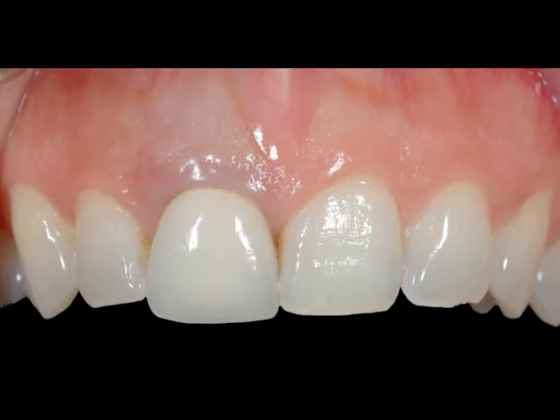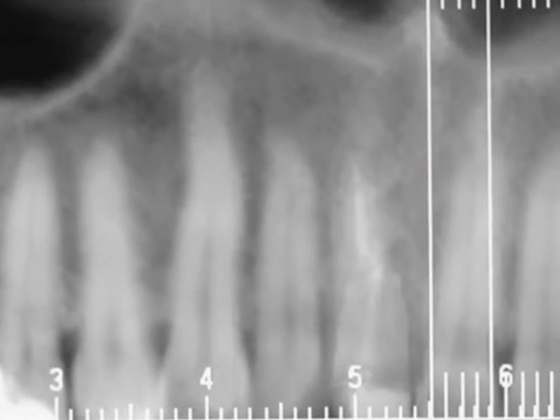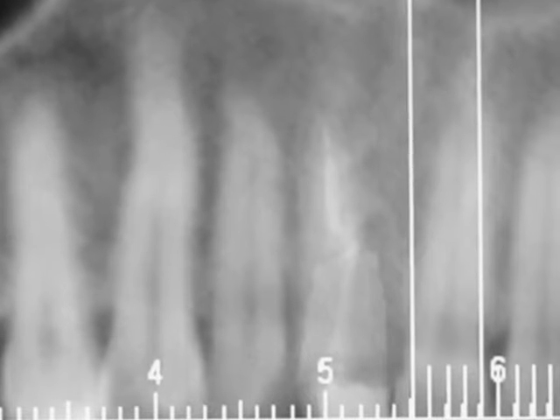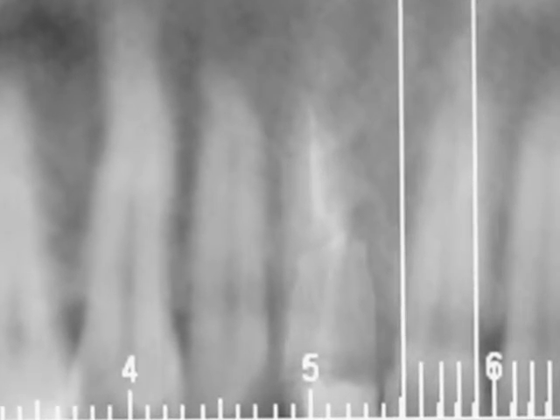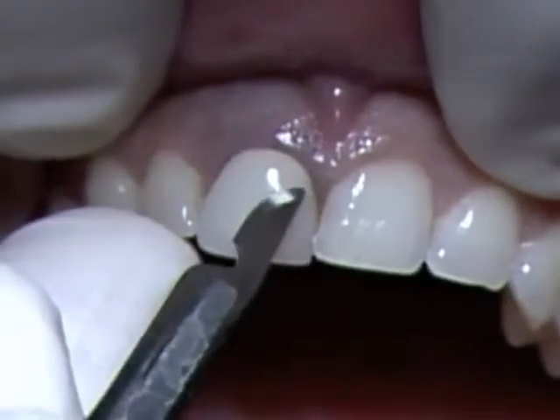But overall, the gingival display is beautiful, and the margin of the right central incisor is 0.5 millimeter to 1 millimeter more coronal than the margin of the neighboring incisor, in our favor, of course. Here, in the panoramic view of the CT scan, we can see clearly the fractured tooth and the mesial defect cause of the fracture. So let's start.